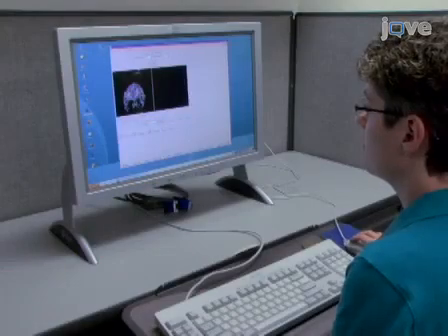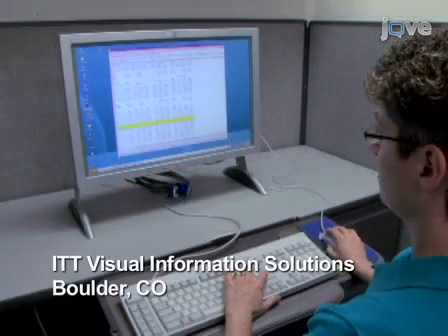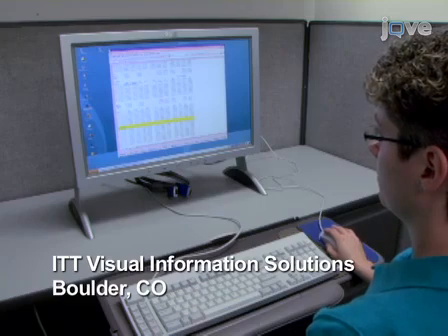DTI scans can be analyzed by first selecting an anatomical region of interest to determine the average diffusion properties of the tissue in a particular anatomical substructure. In our studies, analyses of the diffusion-weighted data are then performed using custom programs written in interactive data language provided by Dr. Kader Hassan.